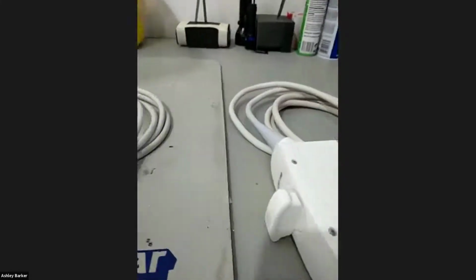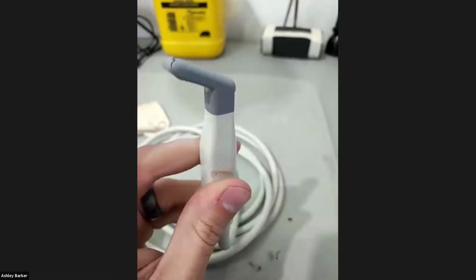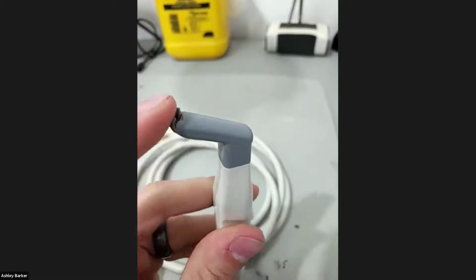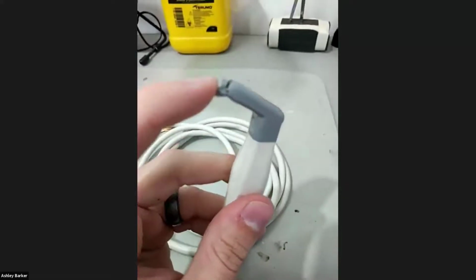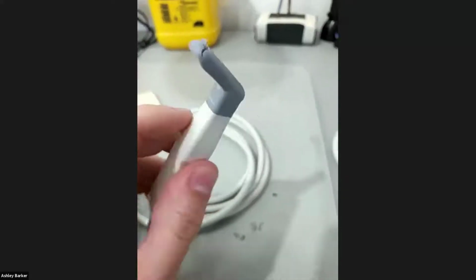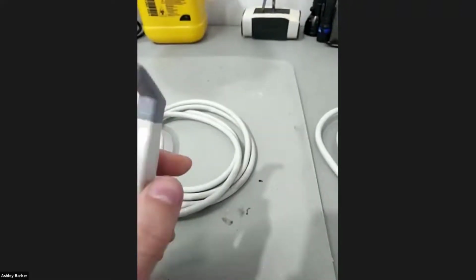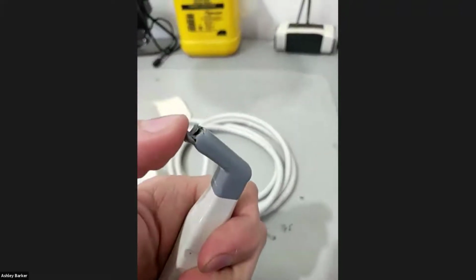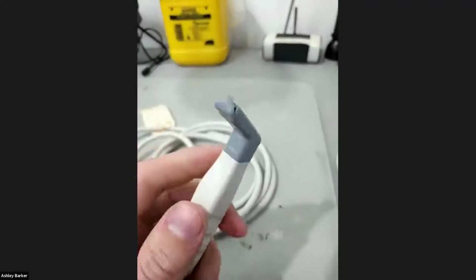Moving on again, this one here, hockey stick probe, and whoops, someone's ripped the end off of the wraparound lens there. And yeah, they've done a fair bit of damage on that. But that's another common one. So they do break if you apply too much force. I'm not quite sure how they managed to do that, but it's like the dogs chewed it.